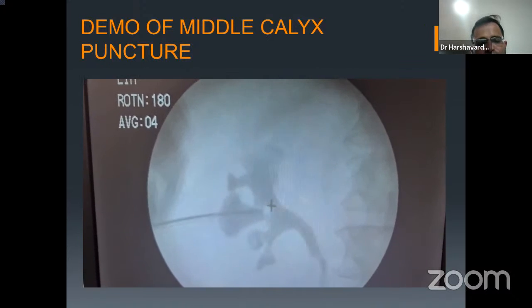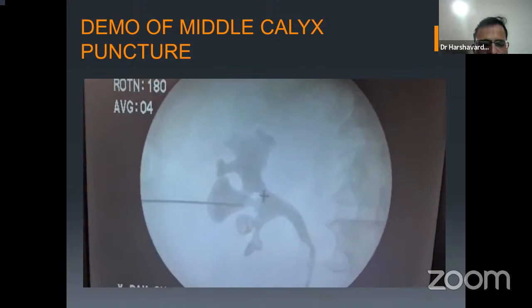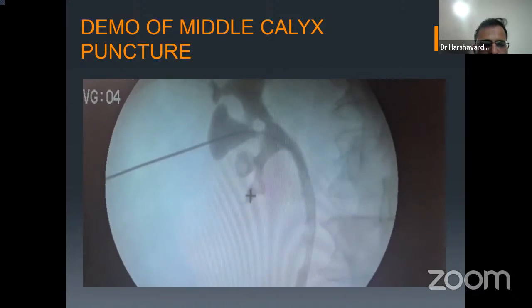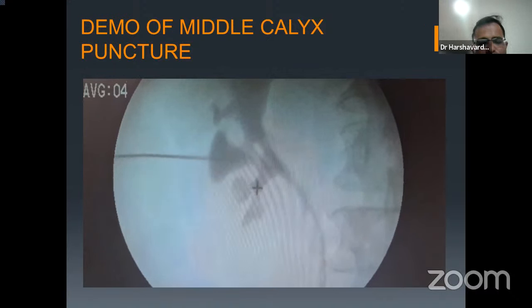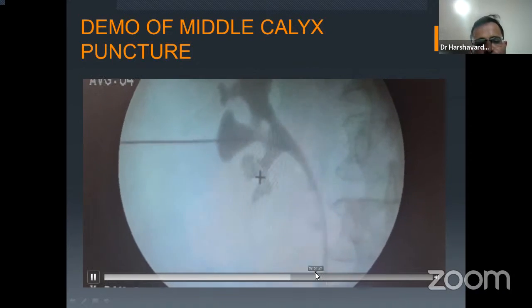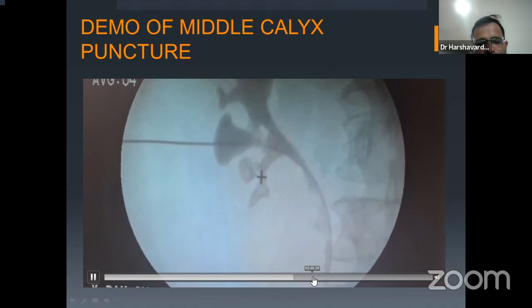So the kidney is moving and we have on the surface view, please. I am inside the kidney. See, the wire has walked into the ureter. There was no resistance to the wire going into the ureter.